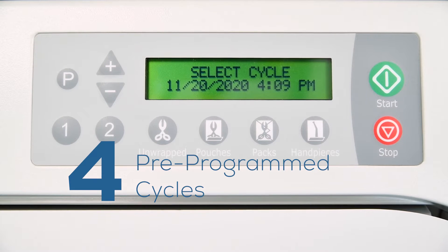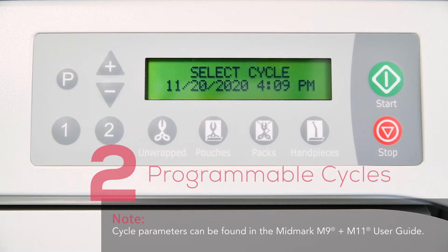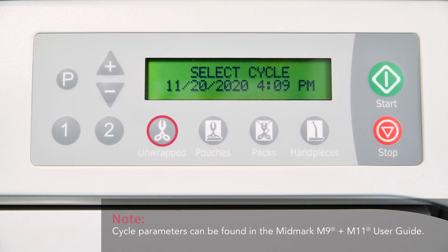Your sterilizer has four pre-programmed cycles and two programmable cycles. The programmed cycles include unwrapped, pouches, packs, and hand pieces.